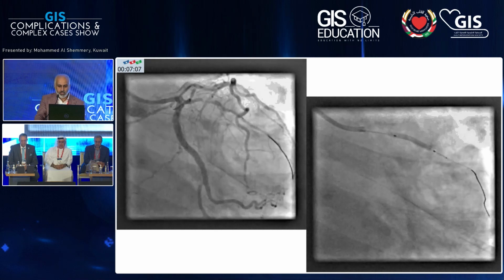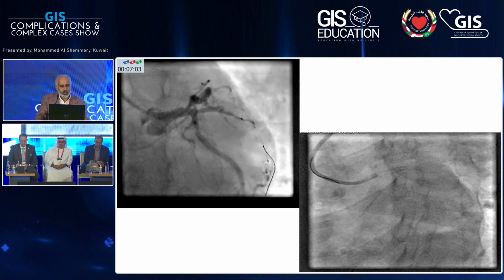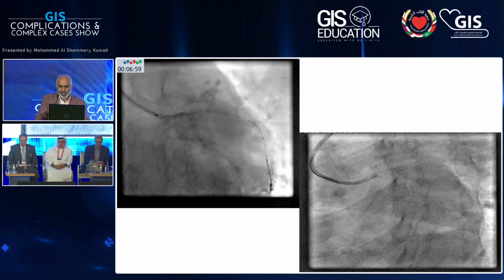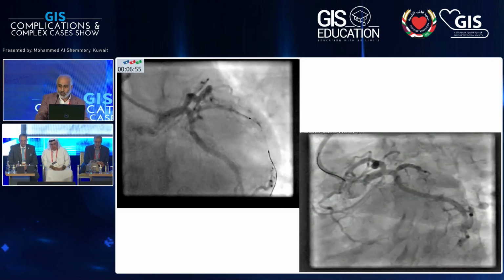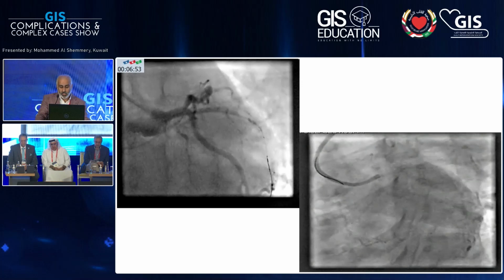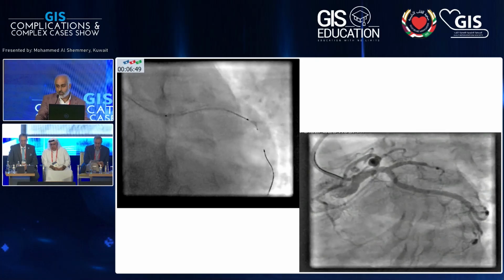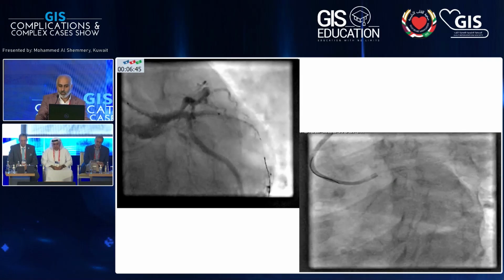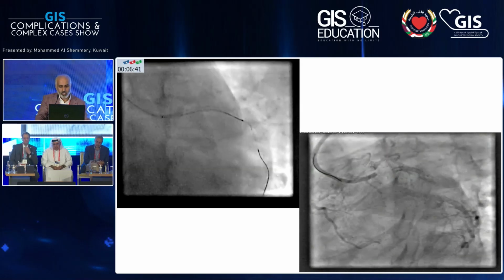After stenting, there was some haziness at the inlet of the stent, so we decided to do OCT, which is the third decision of the case. We were worried about the circumflex ostium having trouble from the stent on the small OM. There was nothing there apart from small area of focal under expansion, which we post-dilated.